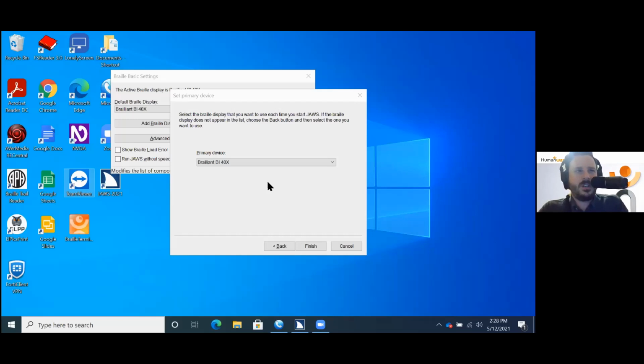The other thing you can do here is, from the Braille keyboard, you can emulate all of your QWERTY keyboard modifier keys. There are JAWS commands, there are Windows commands, there are editing commands that are universal. They're not part of JAWS. So for instance, the command to close a window is Alt F4. The command to print when you're in Microsoft Word is Control P, right? Those are just commands that you would want to execute, and we can do those from the Braille display. The way we do that when we're running JAWS is we use spacebar and dot 8, or Enter. So spacebar and Enter combined with the other keys on the Braille keyboard that emulate different modifiers.